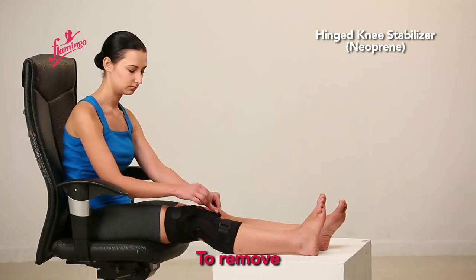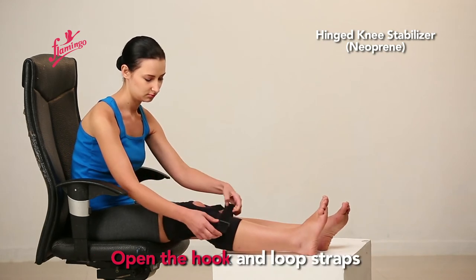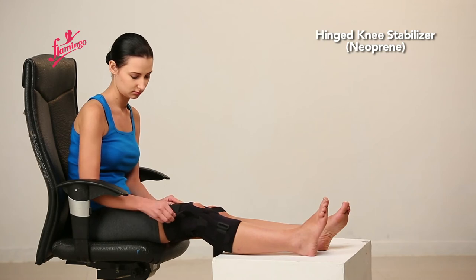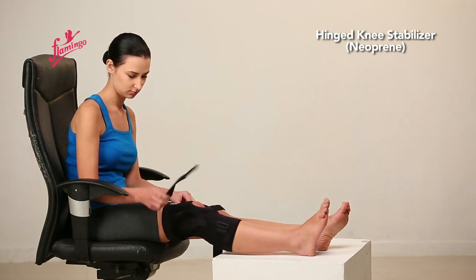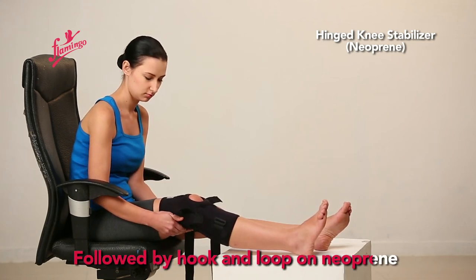To remove: open the hook and loop straps on the patella, then open the other hook and loop straps, followed by the hook and loop on the neoprene.